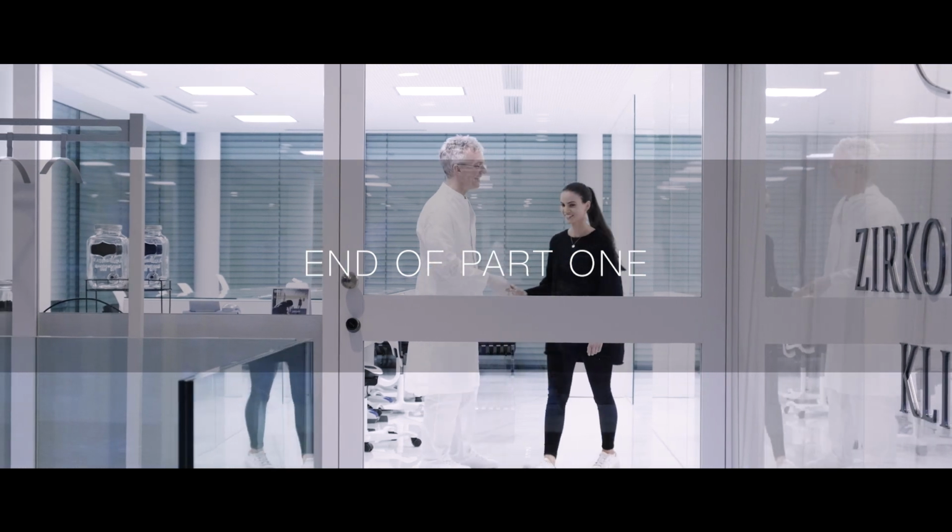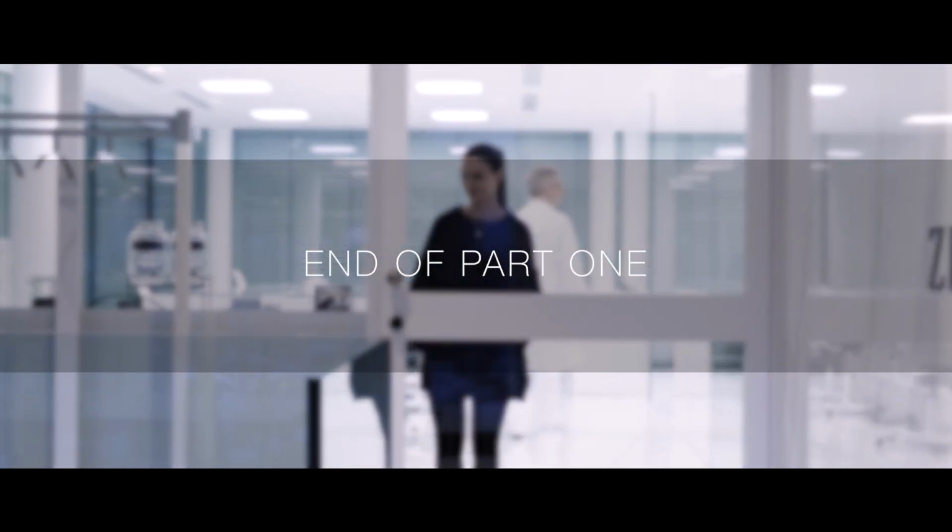At this point, the registration process of patient data is completed.